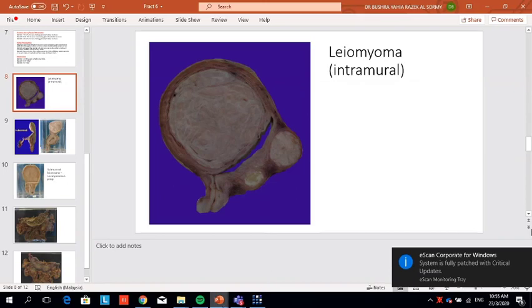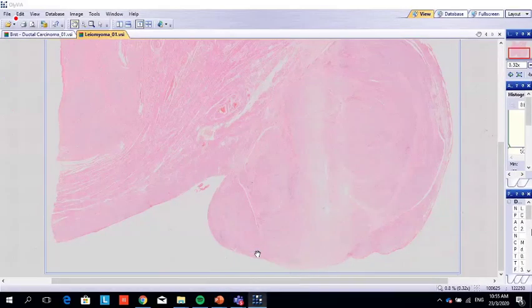Alright then. So we back to this one. What's this condition? We said leiomyoma, leiomyomata. In this condition, benign or malignant? List the features that support your conclusion. Well differentiated, non-invasive, no hyperchromatism, no pleomorphism. I think that's it.